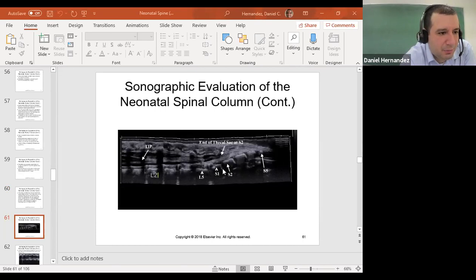So this is going to be that lumbosacral junction between S1 and L5. Or you can go from that last echogenic structure and count caudally. I'm sorry, cranially. So S5, S4, S3, S2, S1, L5, L4, L3, L2. So your tip here is just below the level of L1, so between L1 and L2, so that's normal.